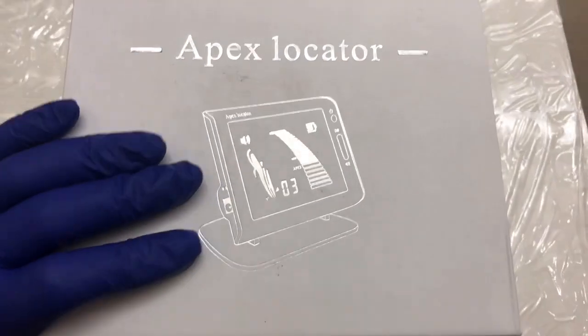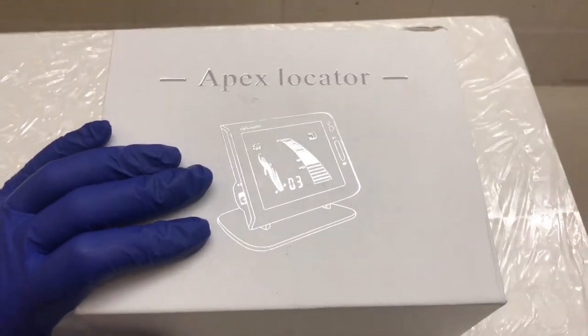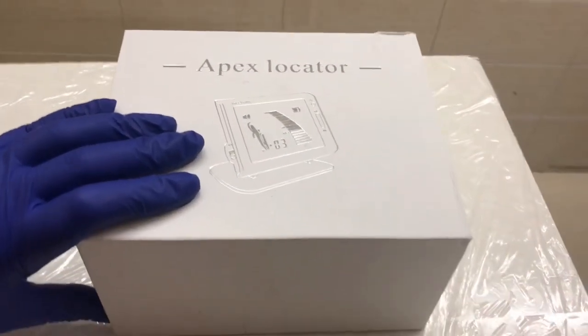Hey friends, this is the 3rd generation Apex locator with multi-frequency avatar position technology from Nexus Medudin NMD.